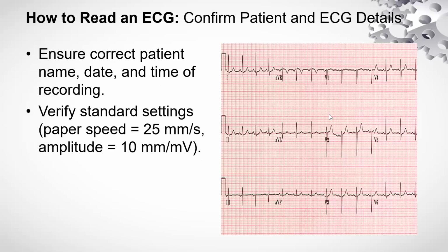So how do you read an ECG? This is where we are coming to the nitty-gritty of today's presentation. I hope all of us will try, if we have an ECG machine in our units, tomorrow or Monday to see if you can record a 12-lead ECG of a patient. But if the ECG has been recorded, how do you read it?